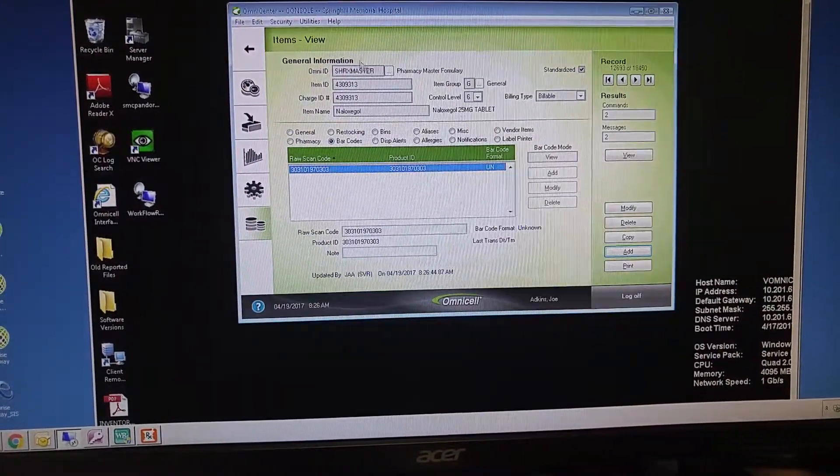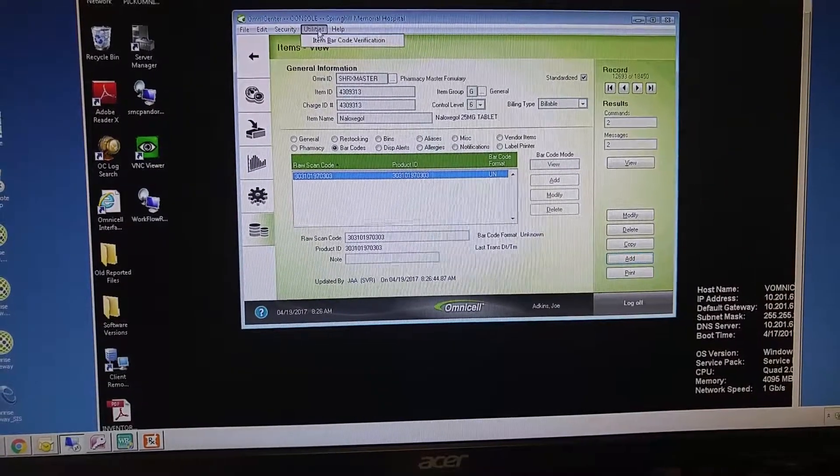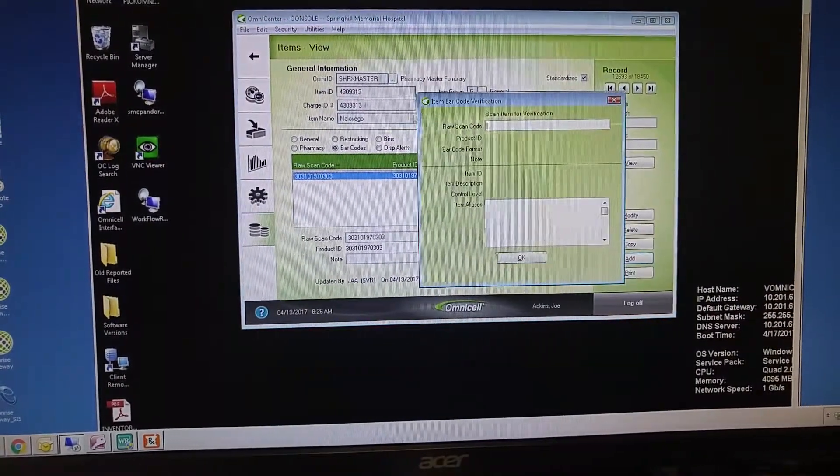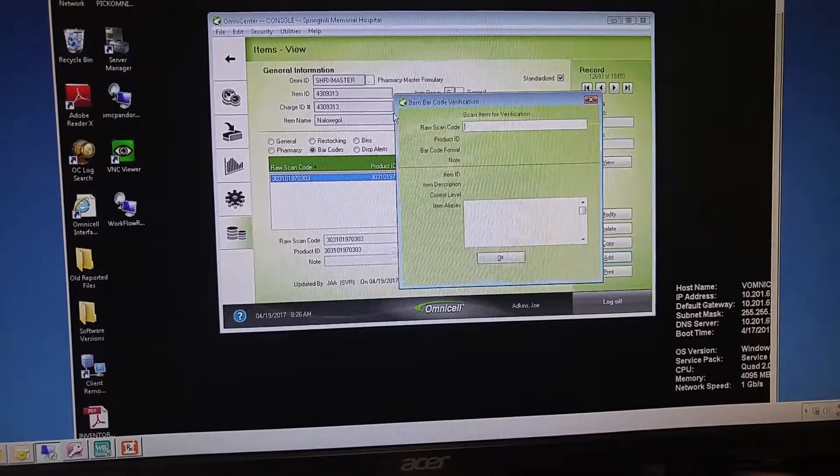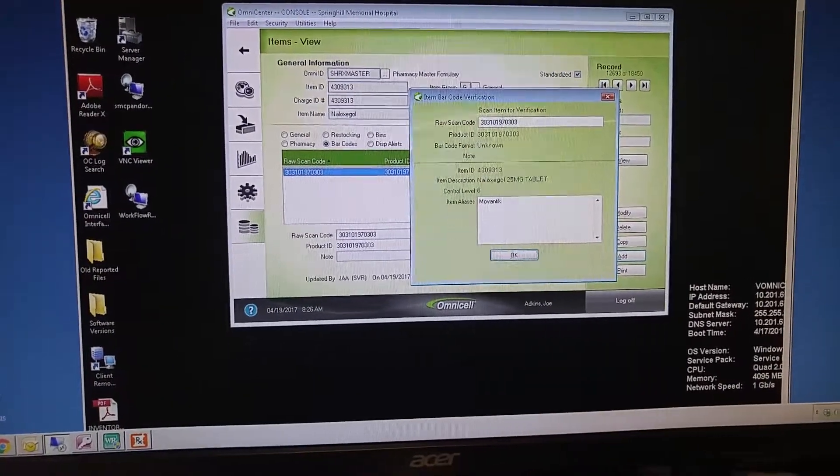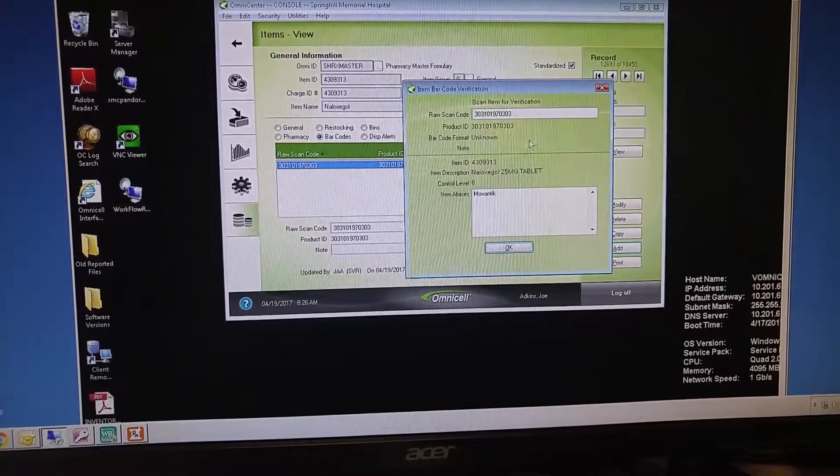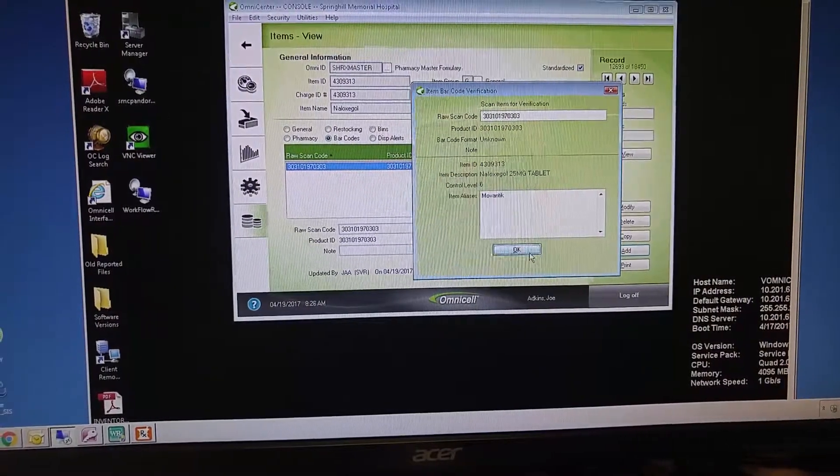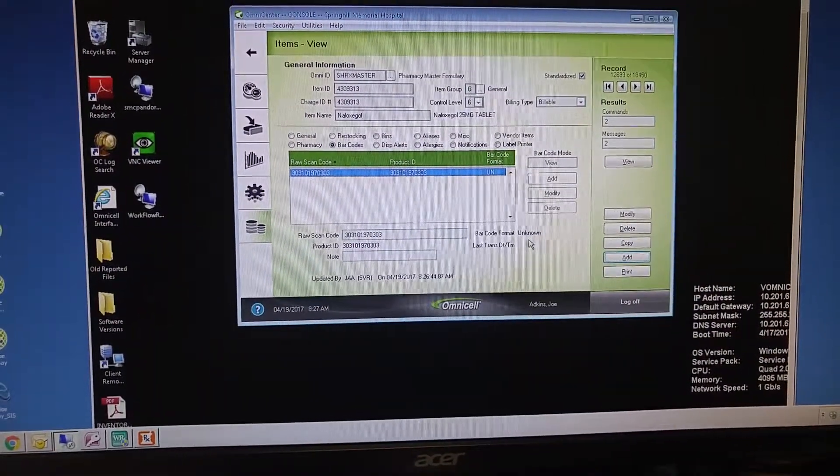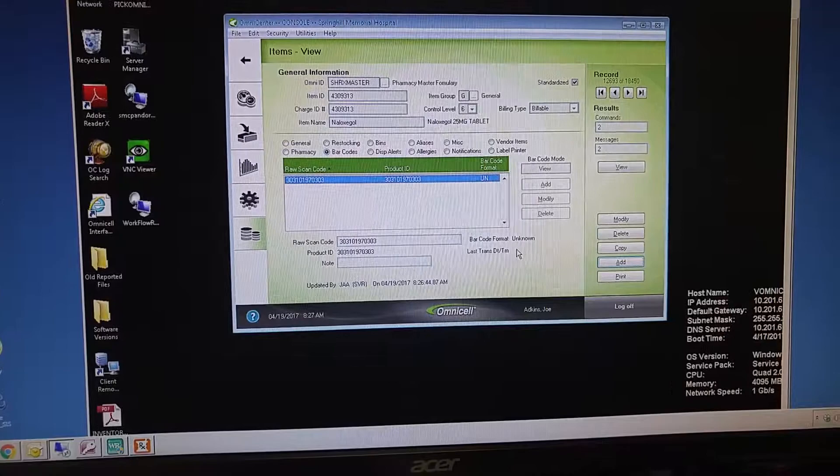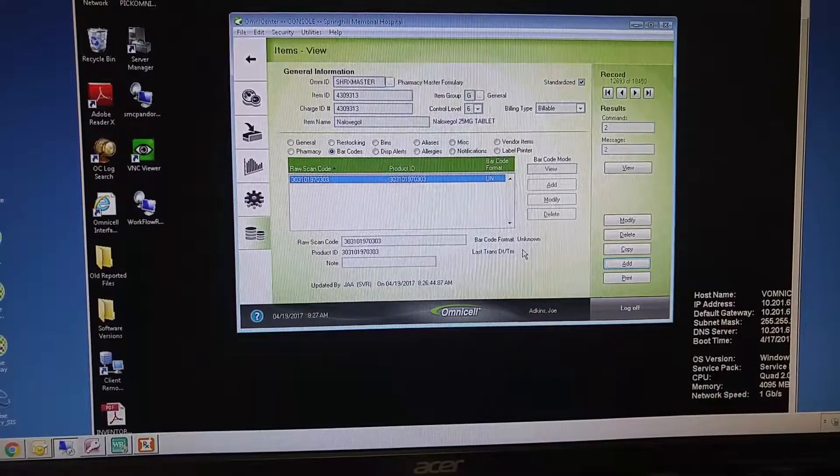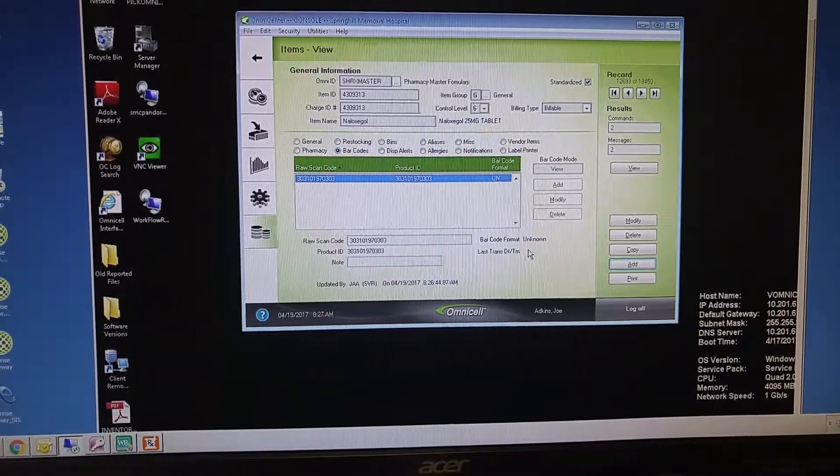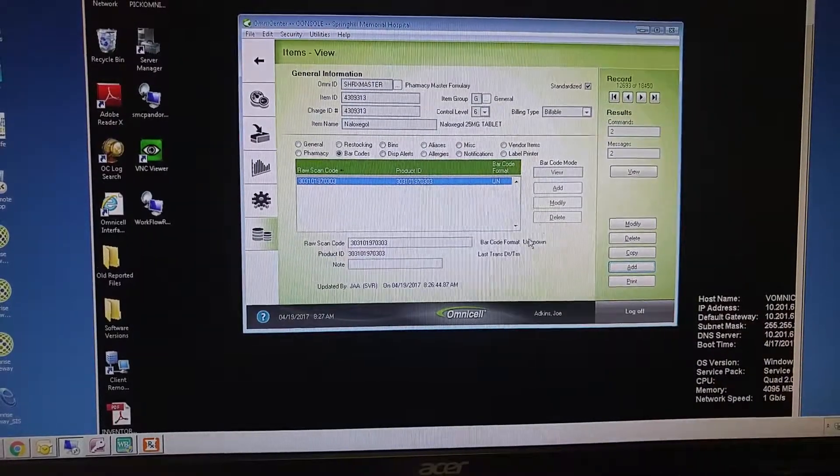And up in Utilities, if you want to double-check and verify that you have added the barcode correctly, give it a scan. Naloxagol is now added to that barcoded item. That is how to add barcodes to OmniCell. This will then flow to all of the units and all of the different areas where this particular item is.